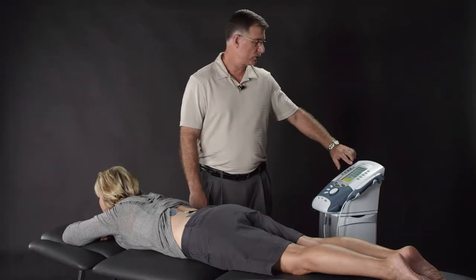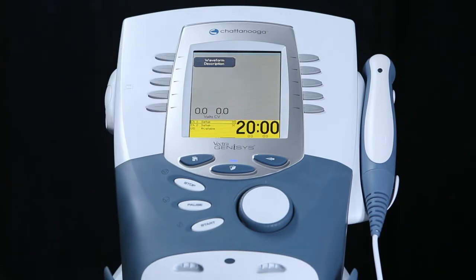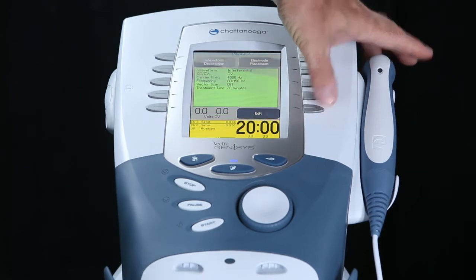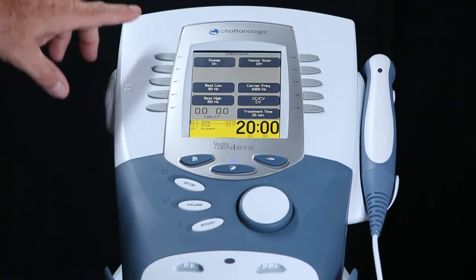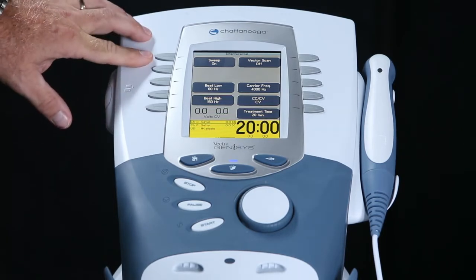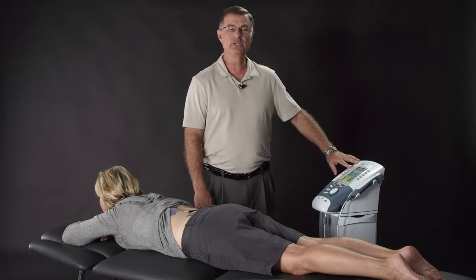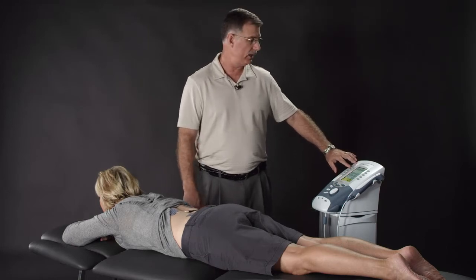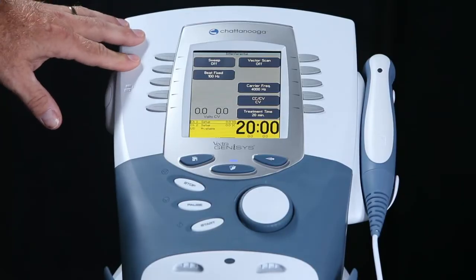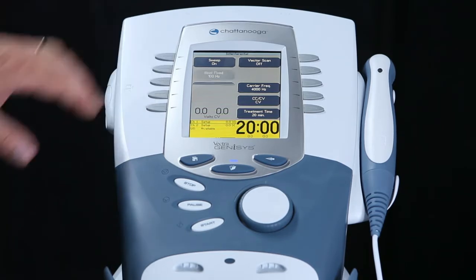First thing we want to do is press the electrotherapy key. Then we press the interferential key. And now we want to edit the parameters to get our correct therapeutic effect, so we press the edit key. The first parameter that appears is the sweep. This modulates the frequency. Modulation prevents accommodation and therefore reduces the amount of times that we have to turn the unit up so that the patient feels the current. If we turn the sweep off, then the frequency is fixed. For our purposes, we want to have the sweep on.